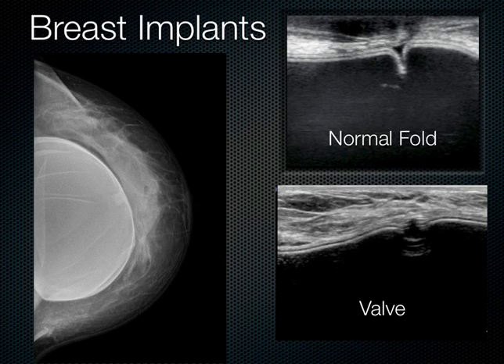Now, what about breast implants? This is something that we see that comes into the emergency department actually quite often. Everything from acute post-surgical issues, regarding wound healing and things like that, to trauma patients and possible implant ruptures.